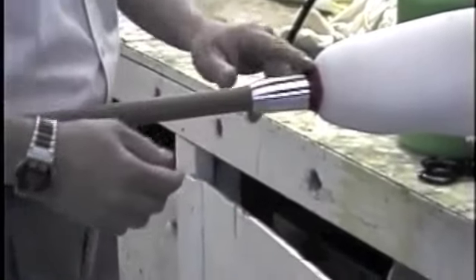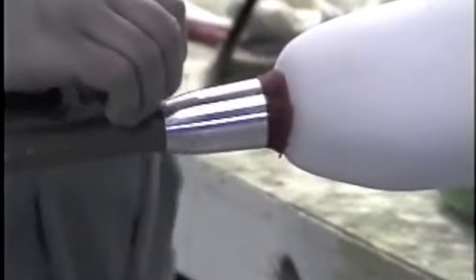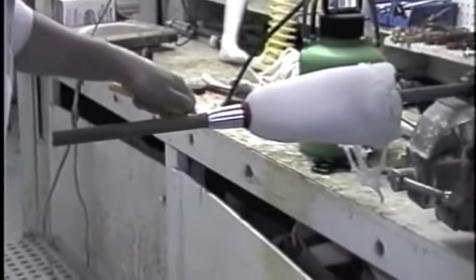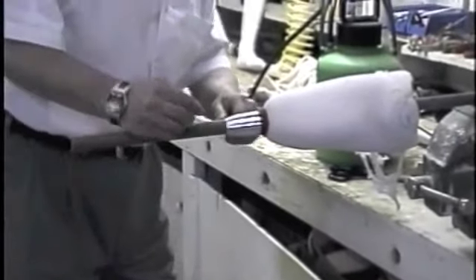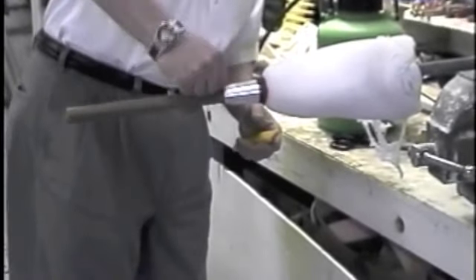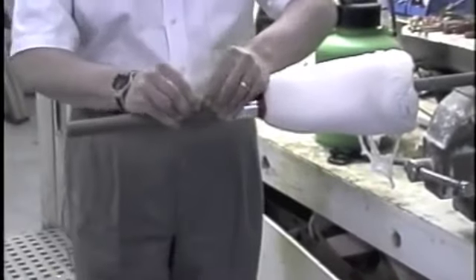Okay, so you can see where the Play-Doh was filled in. I just removed the tape over there. Now, take a sharp edge and cut down the mandrel right through all layers of tape. Because if you let this tape sit on the mandrel overnight, it's going to be almost impossible to get it off. You've got to use acetone and really work it.